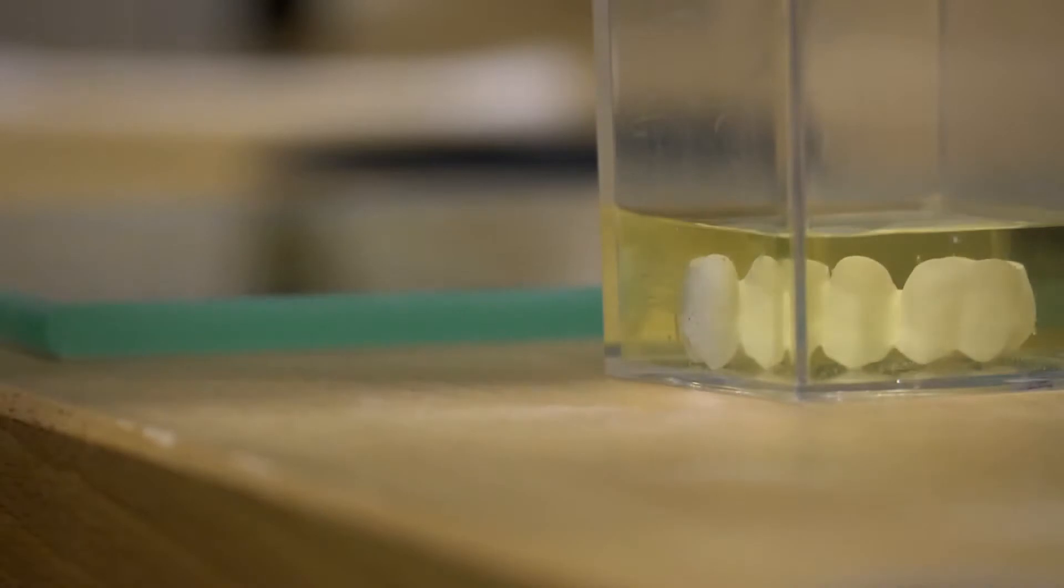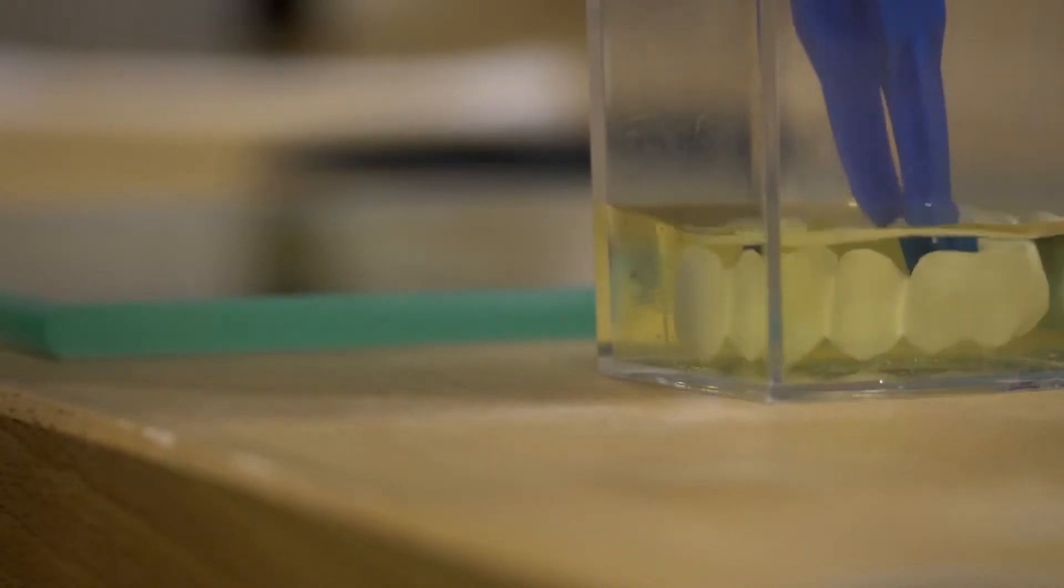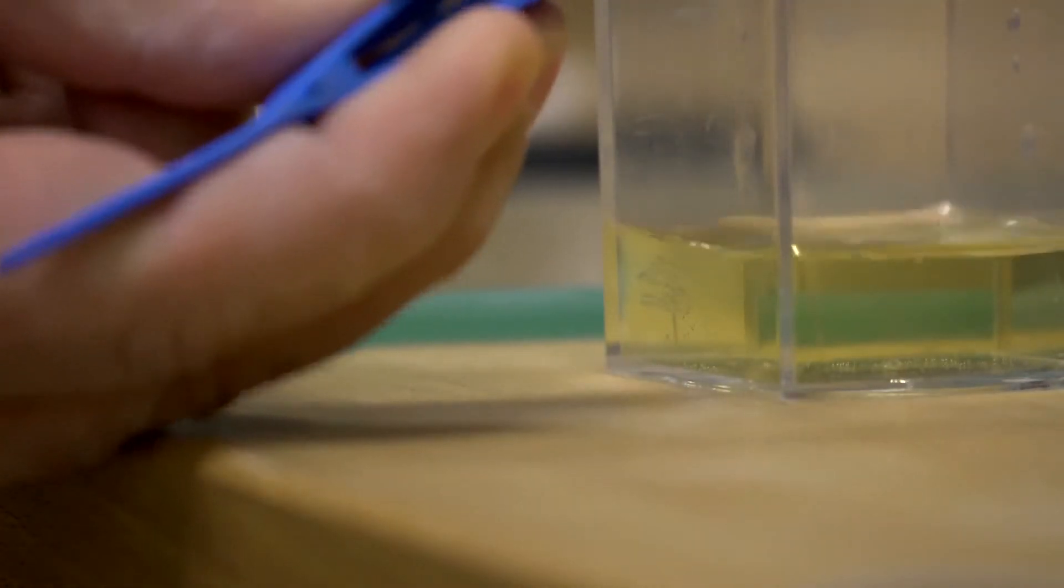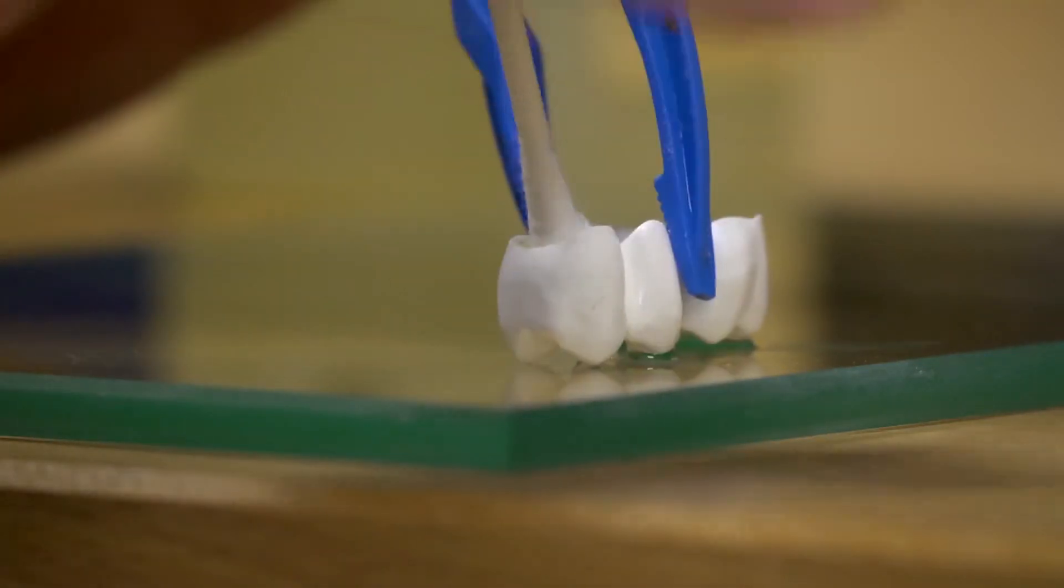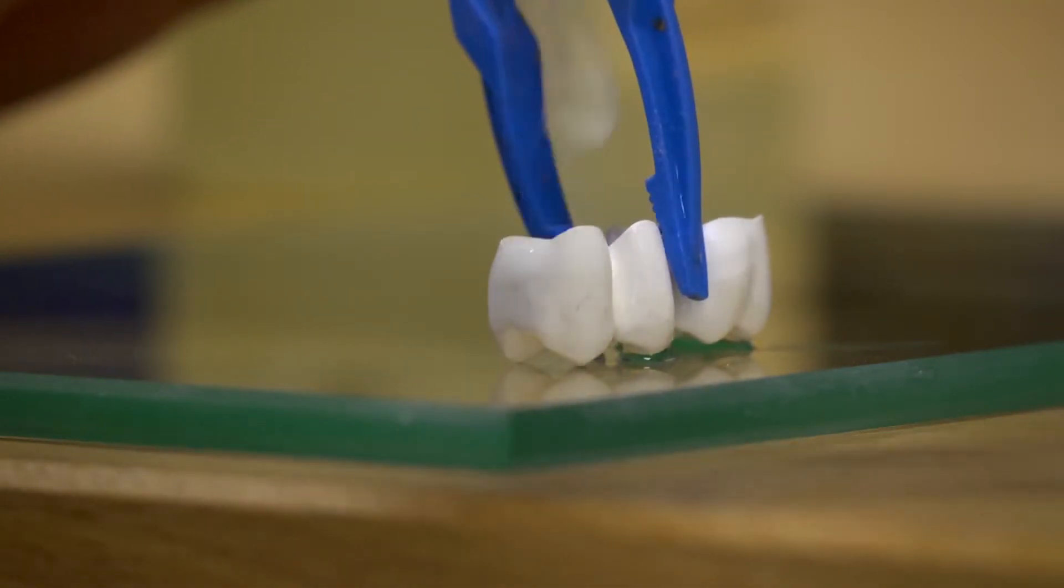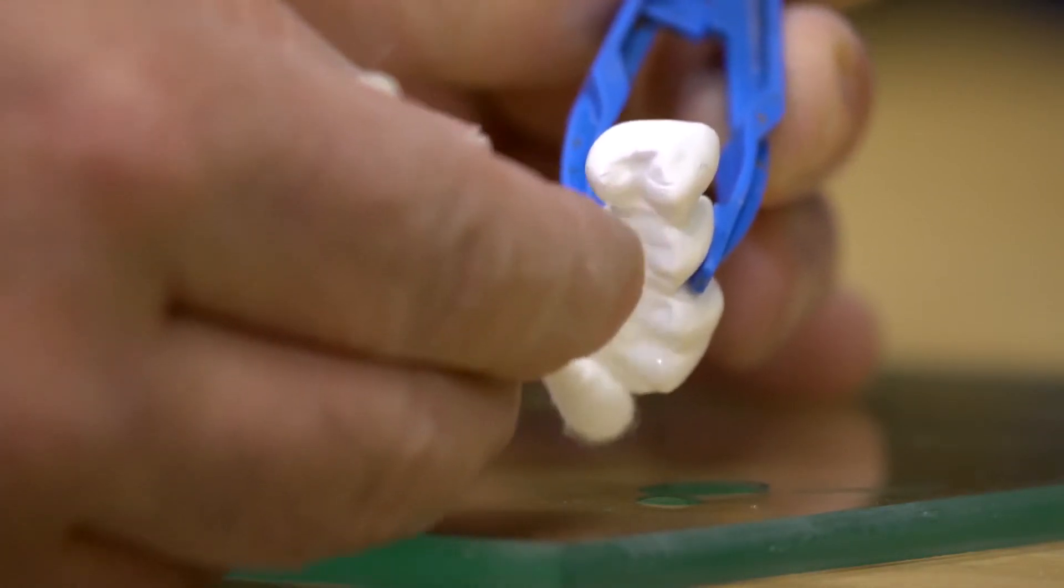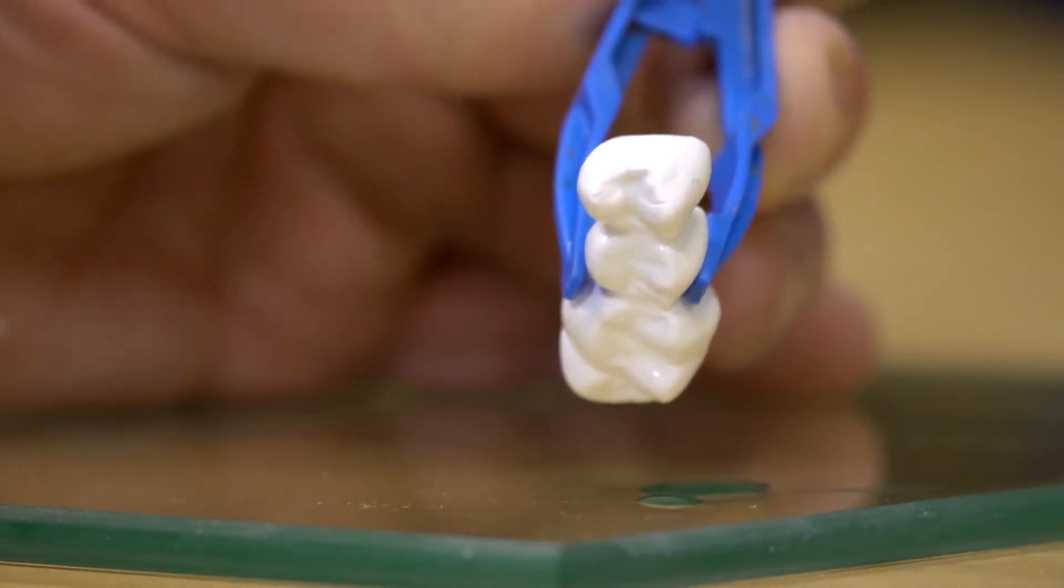Remove the restoration from the glass vessel using a pair of plastic tweezers. Roll the end of a tissue and dab to remove the excess liquid. Now, place the recently colored restoration onto a non-absorbent surface such as a glass slab for at least 15 minutes.